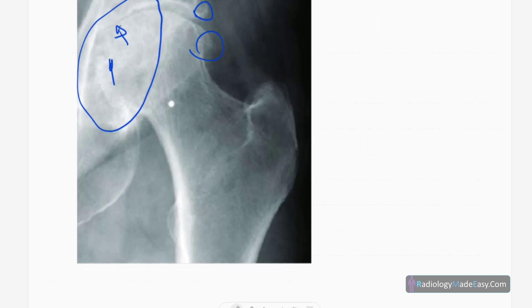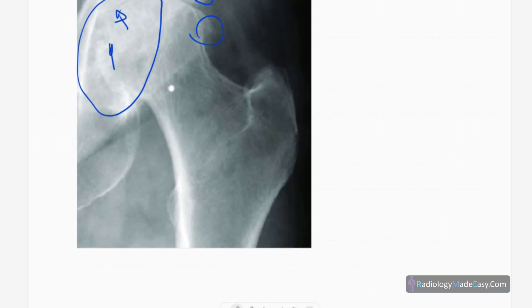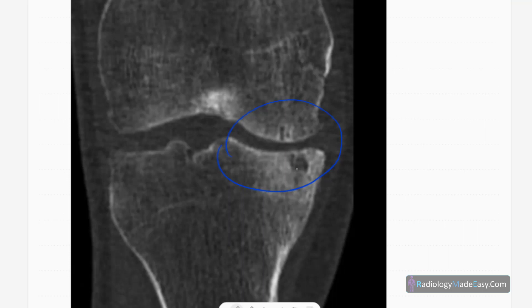This is the CT bone window for an osteoarthritis patient. You can see medial joint space narrowing, subchondral sclerosis, and a few osteophyte formations.